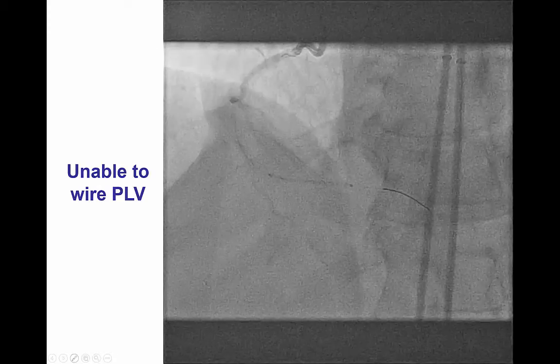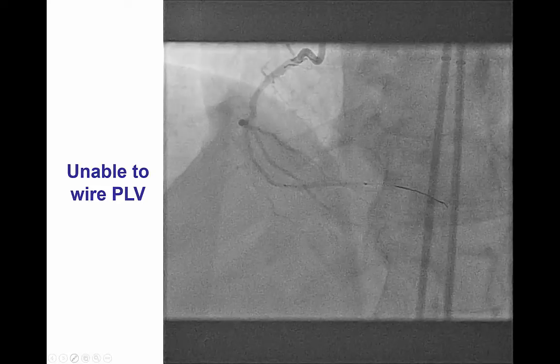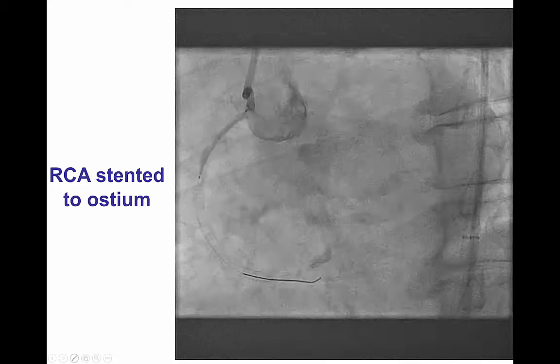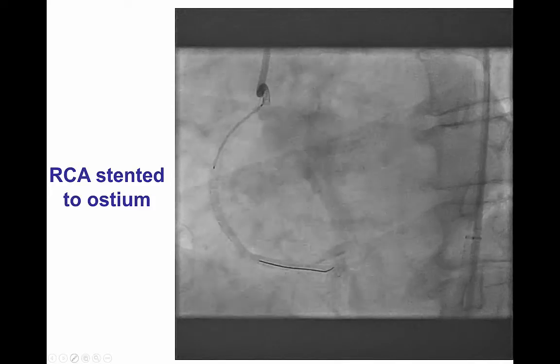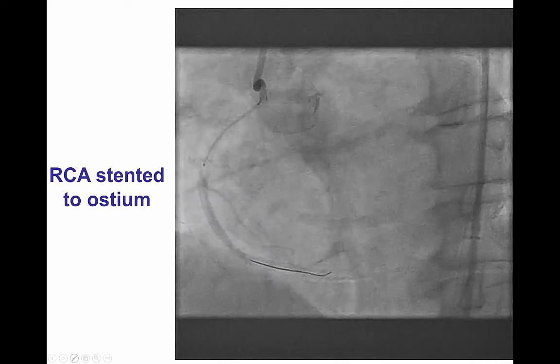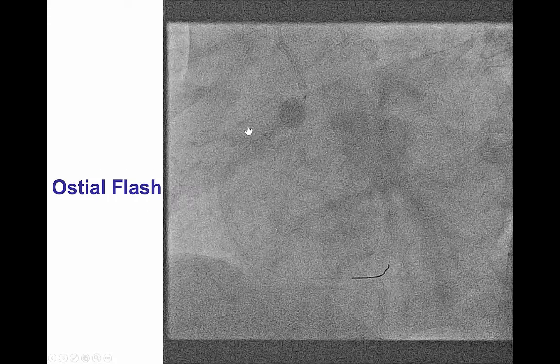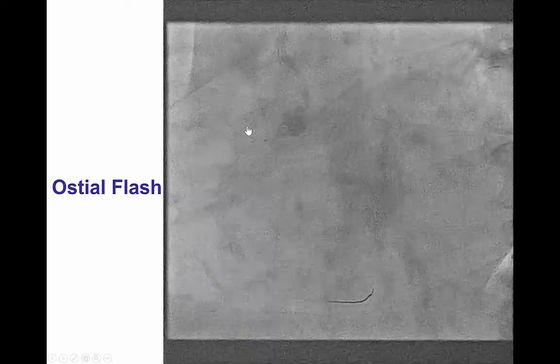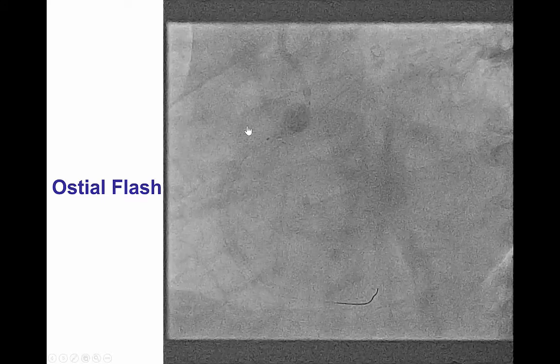At some point a decision was made to ignore the posterolateral and just stent the right coronary artery and the PDA. As a result, stents were placed all the way from the distal RCA to the ostium of the right coronary artery, and the ostium was optimized with a non-compliant balloon.